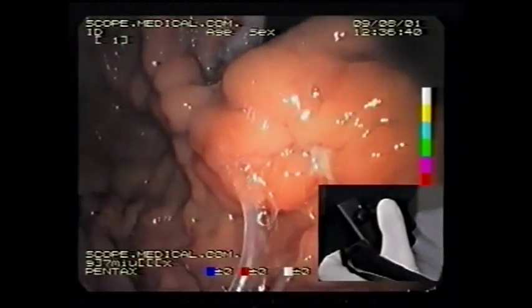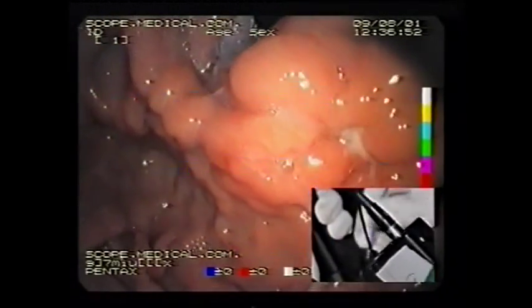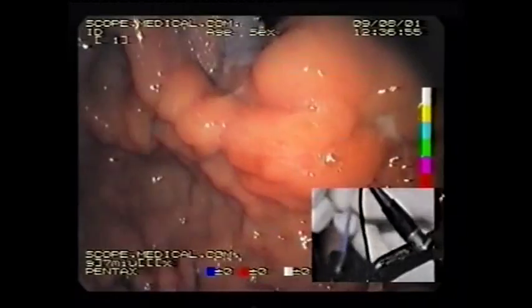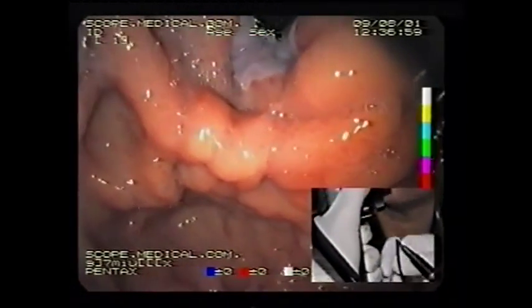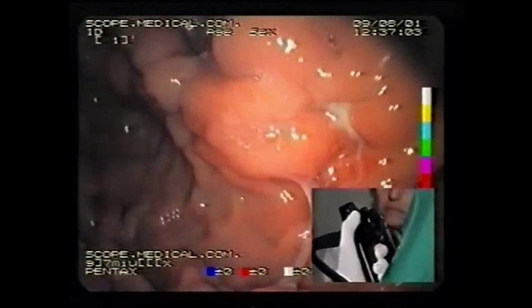So we are now in the retroflex position, and you can still see some superficial ulceration, but you can give me the probe. We can touch this part to see if it's still soft, if there is still an open varix, but it looks very nice. I think this shows the expertise here of this group. Excellent treatment, no more varices.